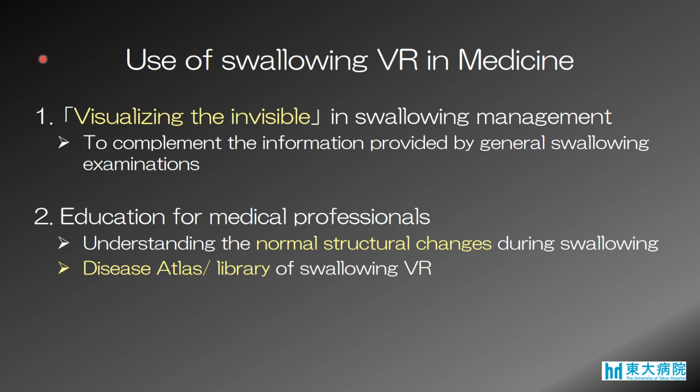Discussion. In swallowing VR, four-dimensional swallowing dynamics are immediately visualized by reconstructing sequential images using a self-developed software program. Swallowing VR system makes it possible to visualize the invisible in swallowing management.